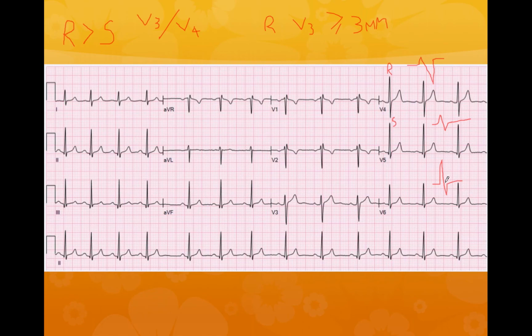It's not such a specific sign, but it can be found in a myocardial infarction, even a past myocardial infarction. I just wanted to clear this up, because I don't think many people understand what people refer to when they say poor R-wave progression. You can also find it in normal individuals.